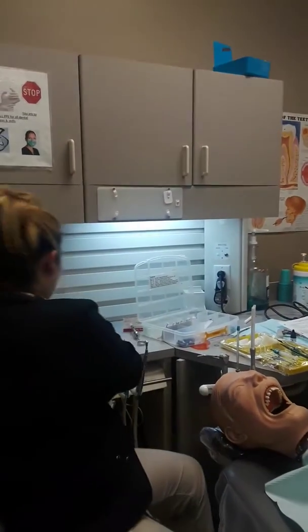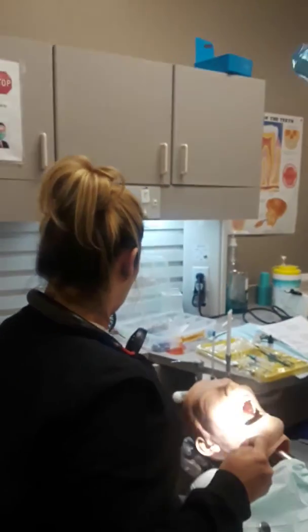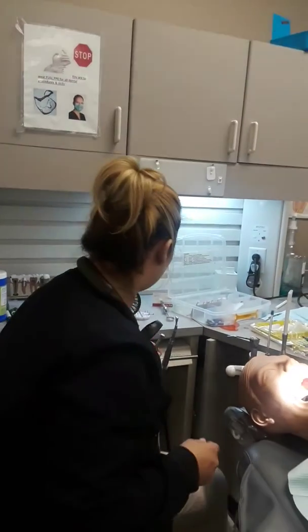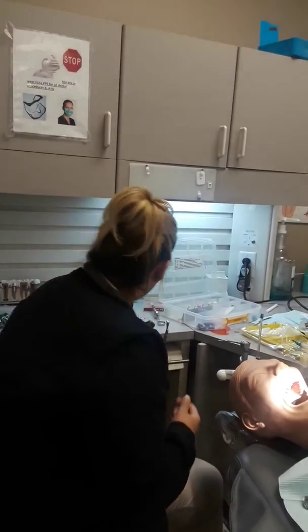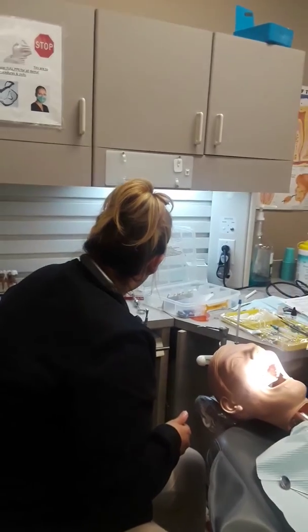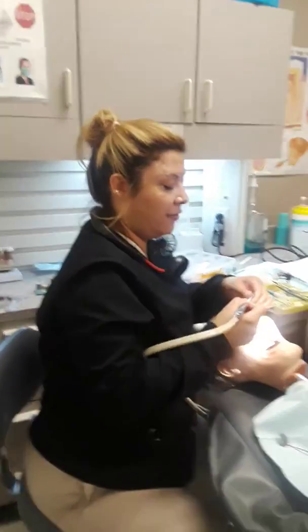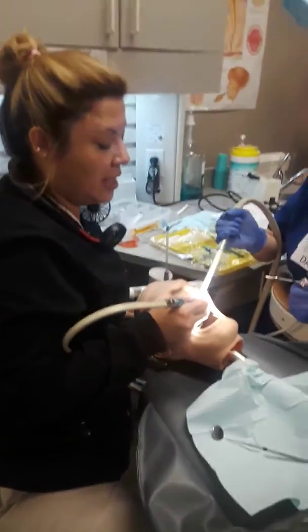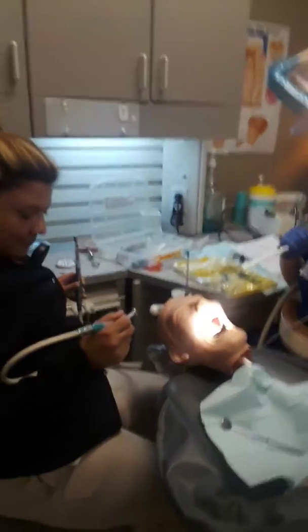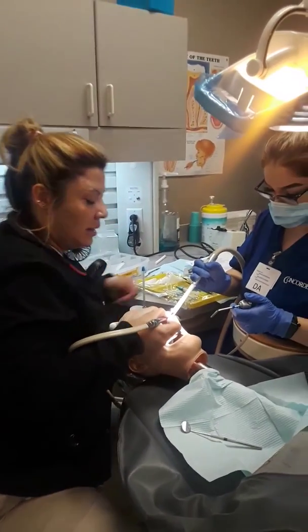She's going to write it down — shade A2 — we'll add that to the progress notes later. Next step: pass high-speed handpiece. We're going to cross off 'pass' because in 14-15 years I've never passed a high-speed handpiece. Doc loads his own bur, and we're going to cut. We'll have our safety glasses on.